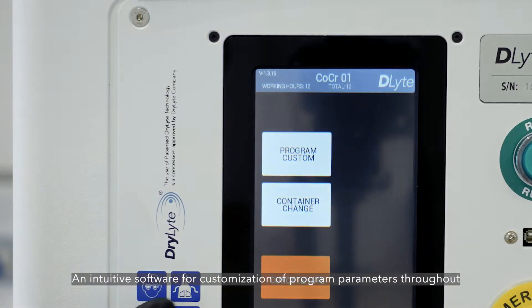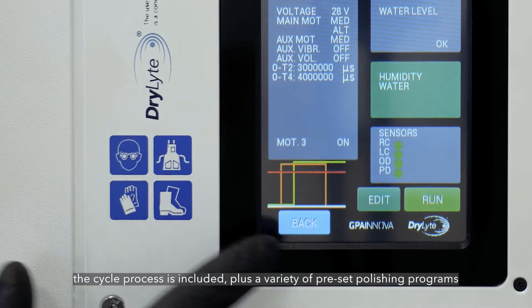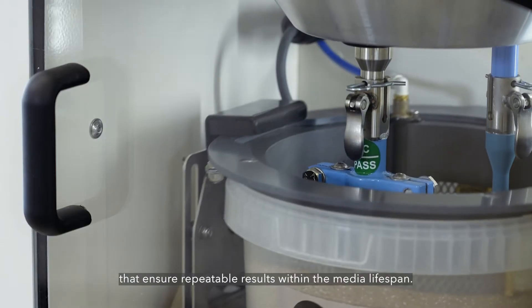An intuitive software for customisation of program parameters throughout the cycle process is included, plus a variety of preset polishing programs that ensure repeatable results within the media lifespan.